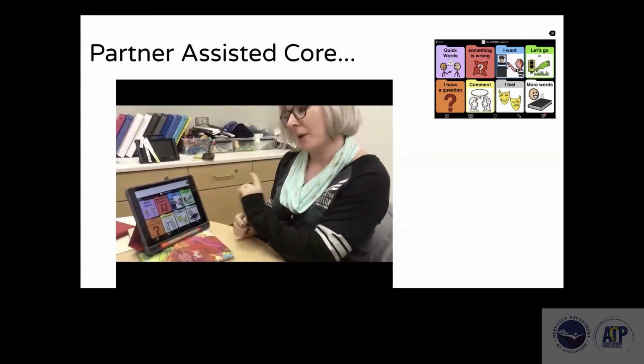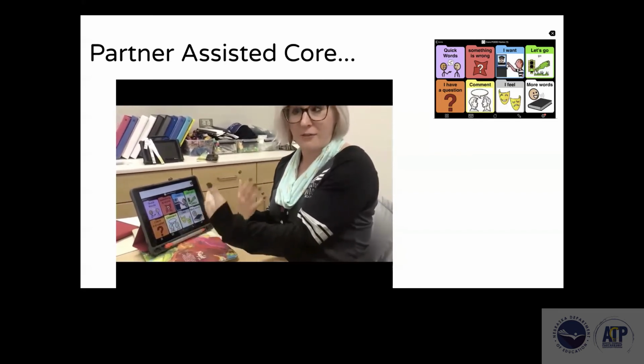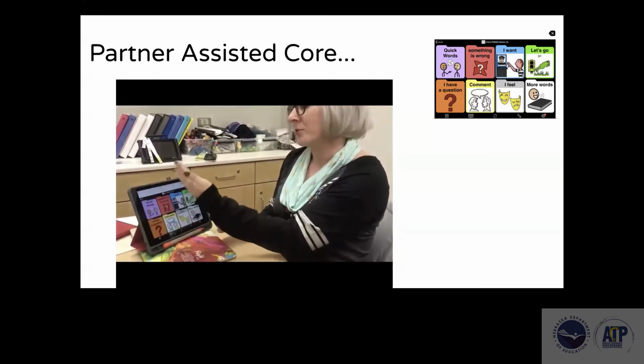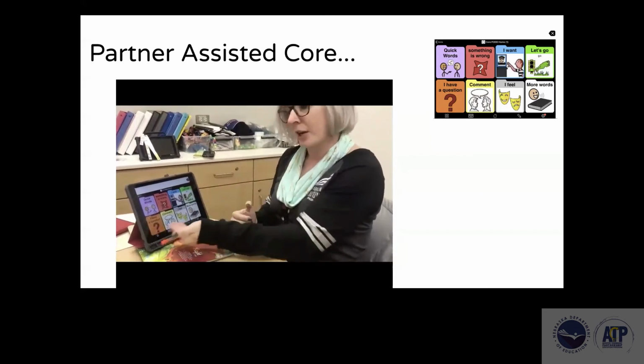So start at the top, and start with quick words, which is where greetings are. And if he remembers, he'll say huh right away. If he doesn't remember, then I go through all the choices. So I go through the quick words, something's wrong, I want, let's go, see if he gives me a yes or a no answer. Then I go to the bottom line.